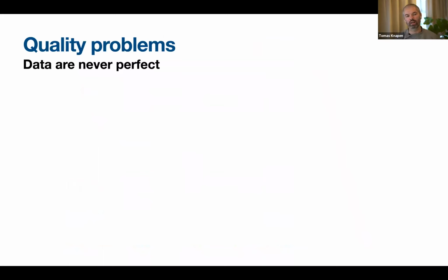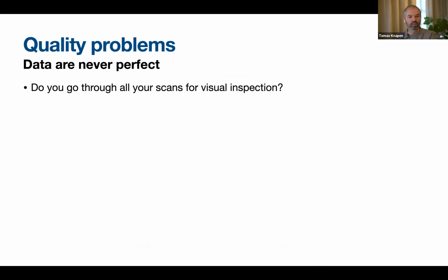I want to highlight one other thing. If you save everything in this BIDS format, this allows you to go through quality control problems much, much faster. So I've been telling you that fMRI data is really crappy. And this was up until now only the ways in which it is predictably crappy. However, fMRI data is also unpredictably crappy. It means that in principle, you have to go through all of your scans, visually inspect them, and quantify their quality in many different ways.